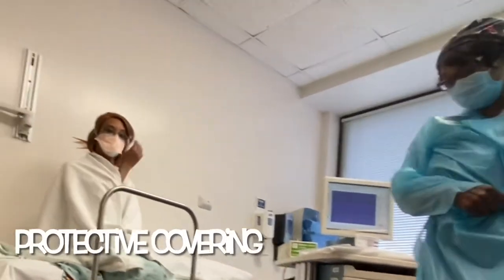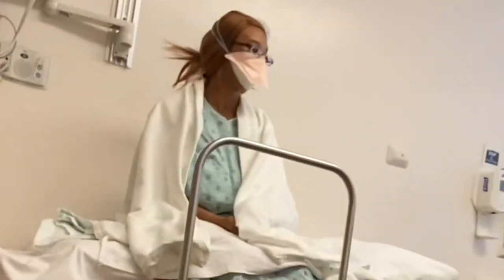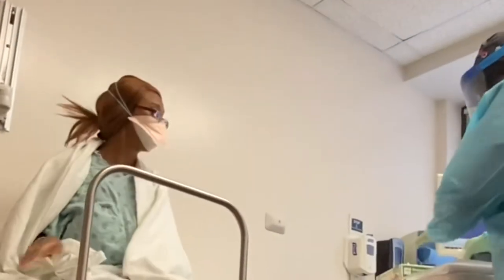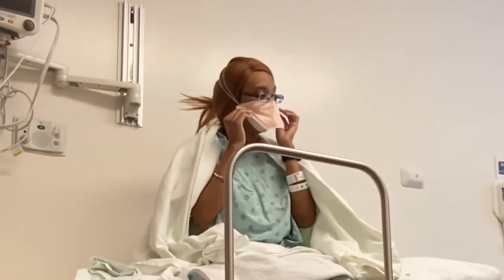Okay, here, possible gagging. You okay with that? Yeah, I'm good. Put this towel across your lap. All right, now you take your mask off, please, ma'am. Put the trash can at the bottom. It's right there. Start it here in this pan and then on the towel.